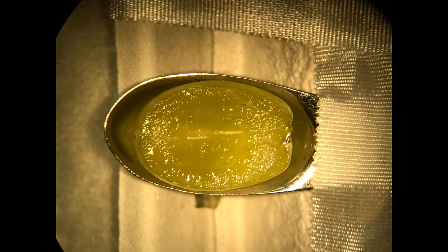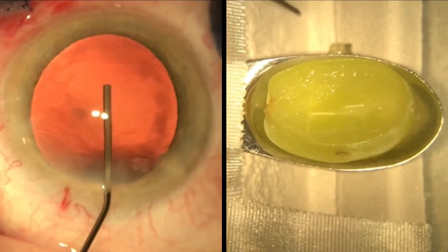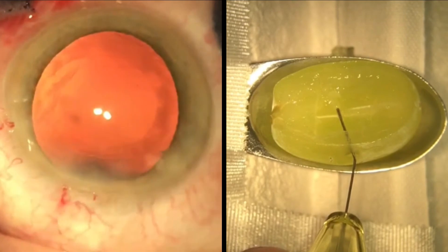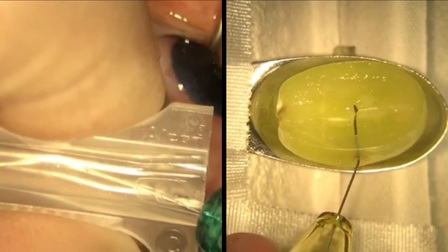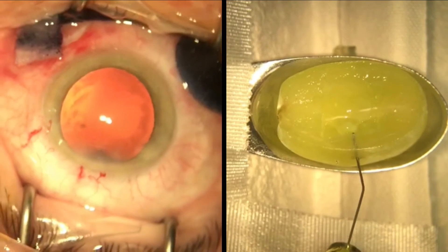This still shows a grape cut in half with a hollow in its centre. After priming the cannula, it is inserted accurately into the hollow in the centre of the grape without exerting pressure on the incision site. Then we gently injected the viscoelastic to fill the hollowed section. As it fills, the cannula is withdrawn while still injecting from a 5 o'clock to 11 o'clock position.